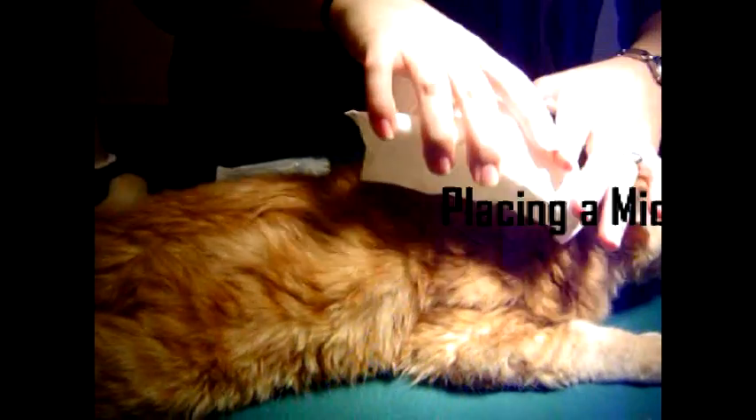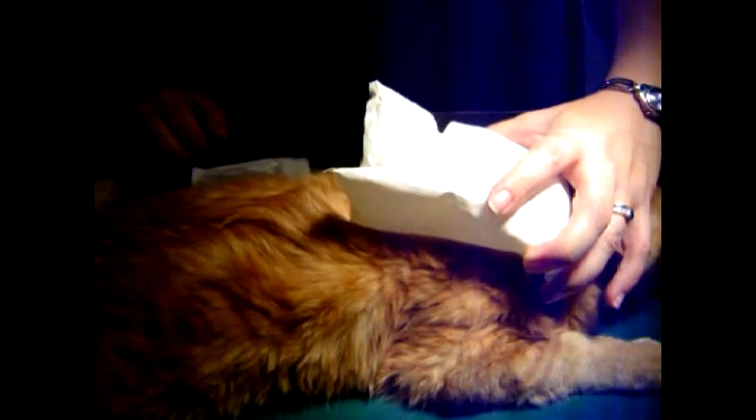We're going to microchip this kitten here. We're going to put an ice pack on his back so that we kind of numb the area so it's not quite so painful.